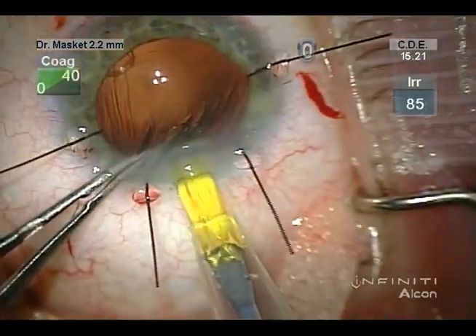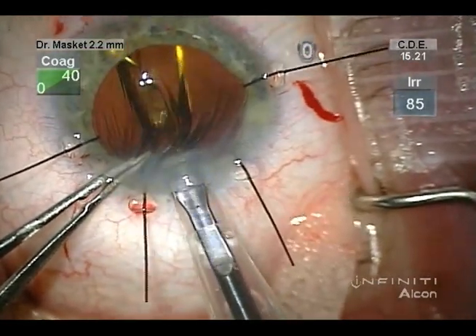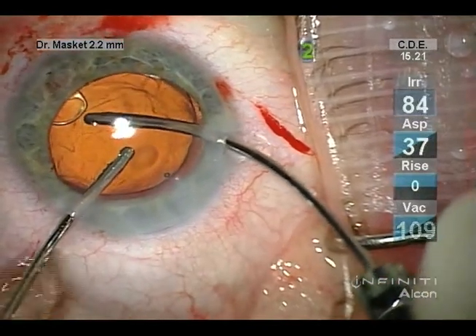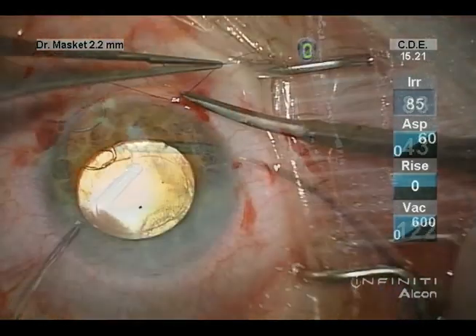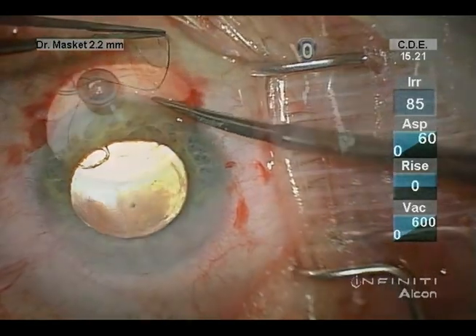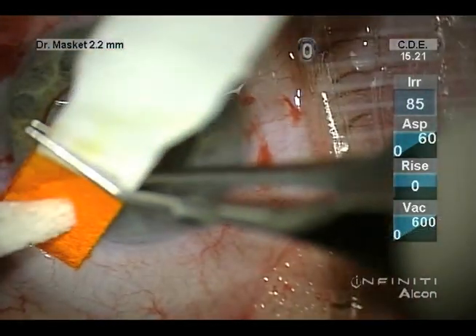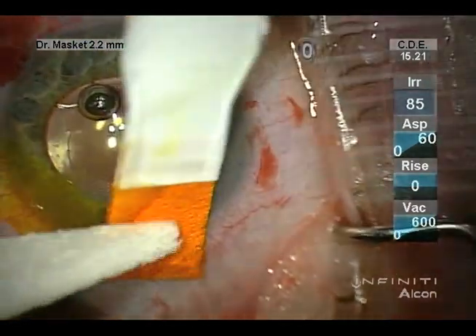One can note now that the capsule bag is supported by a capsule tension ring and capsule tension segment. In this particular case, a single-piece acrylic aspheric lens was positioned, with excellent centration and stability at the end of surgery. Pressure is set at normal, and all incisions are tested with fluorescent dye and point pressure.